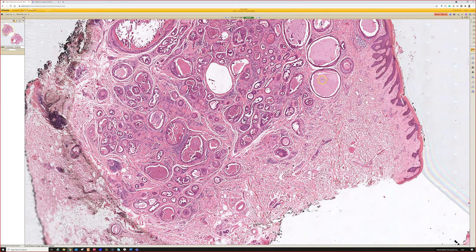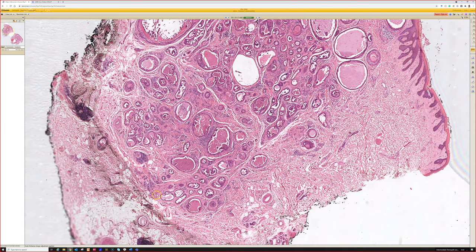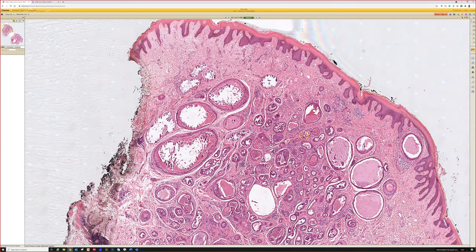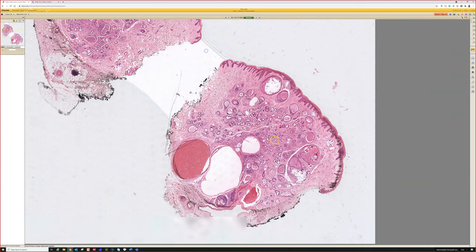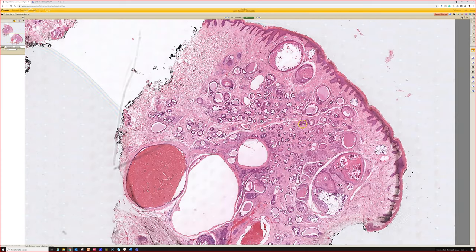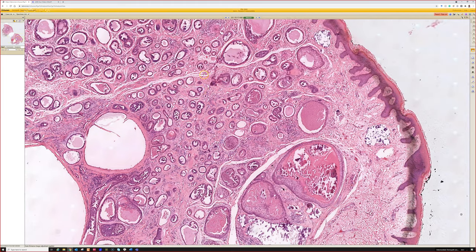But usually if you have a thing completely excised, you can tell that even though the tubules look like they're infiltrating or invading the dermis, they're actually a circumscribed collection if you see the whole lesion from low power, right? You can draw a circle around the whole thing. So I think that's the harder part, if you only get a partial biopsy of one of these, you could struggle with knowing what it was.